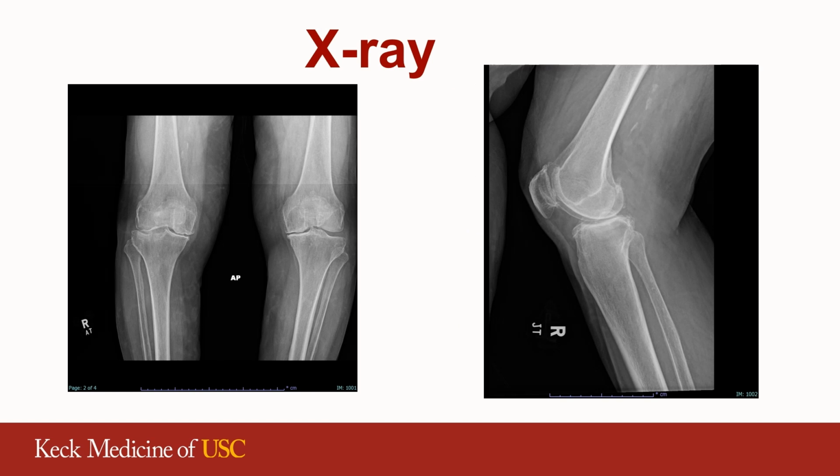So we're starting out with the radio. This patient has bilateral disease, but we'll focus mostly on the right for this exercise. This patient has lost joint space, has varus deformity, as well as a lateral tibial subluxation. And we'll go about characterizing this first on CT scan, and then we'll position our components to match this patient's anatomy.